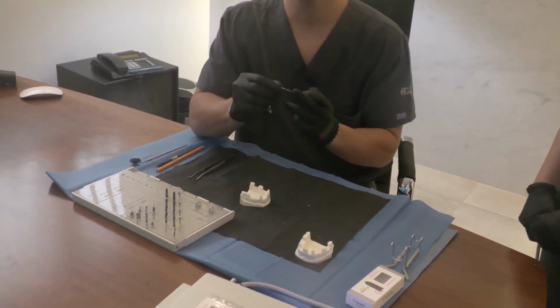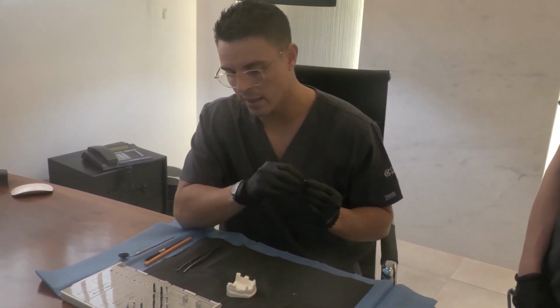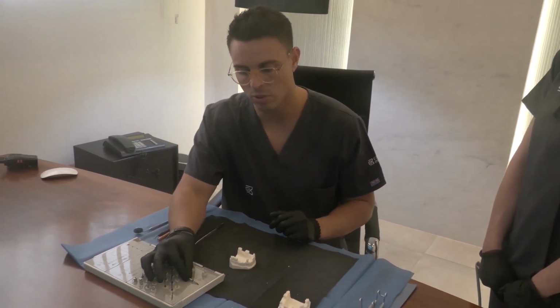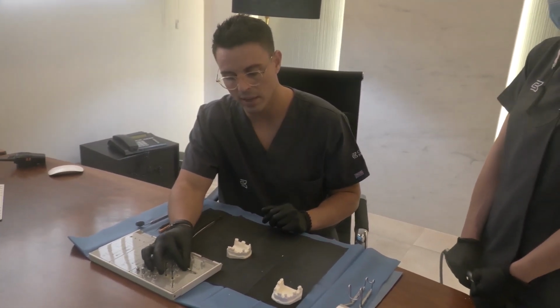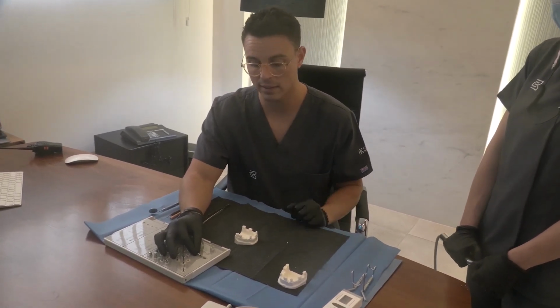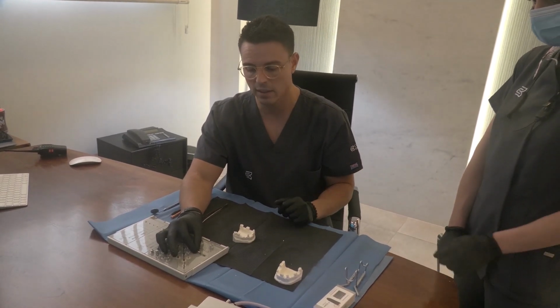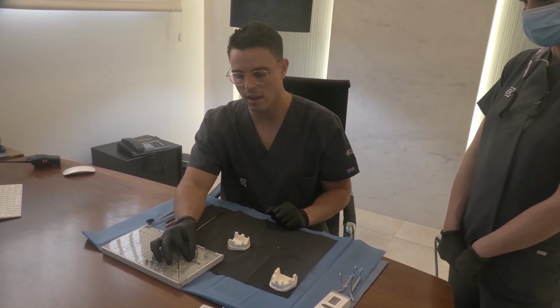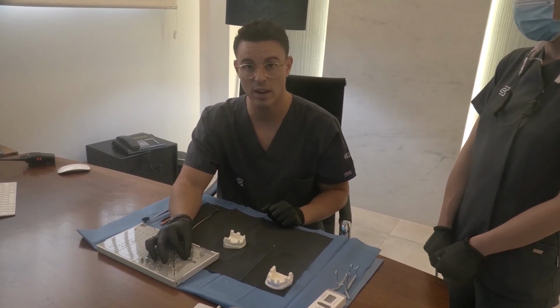Now it's time to use the second burr, which is the 2 millimeter diameter drill, and in order to anticipate the final implant position, it's recommended to use this caliper, this measurement replica. We know the final implant length to be used is about 11.5 millimeters, and we have said previously that it's always desired to sink it about 1 millimeter more, so I will be drilling up to 13 millimeters, roughly 12.5 to 13 millimeters.